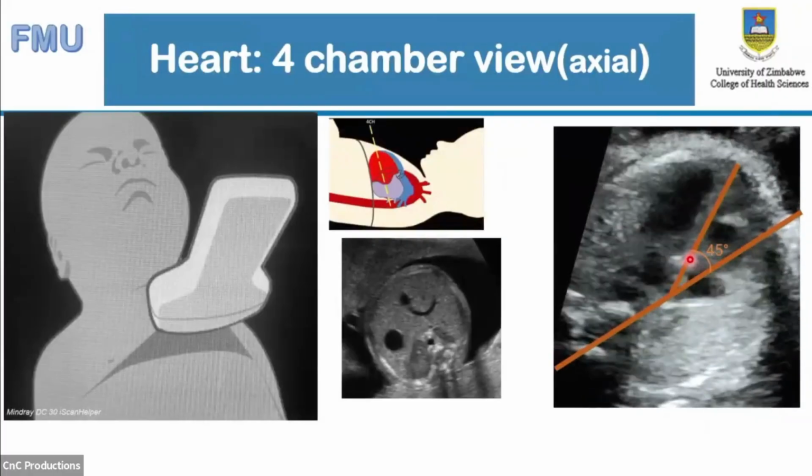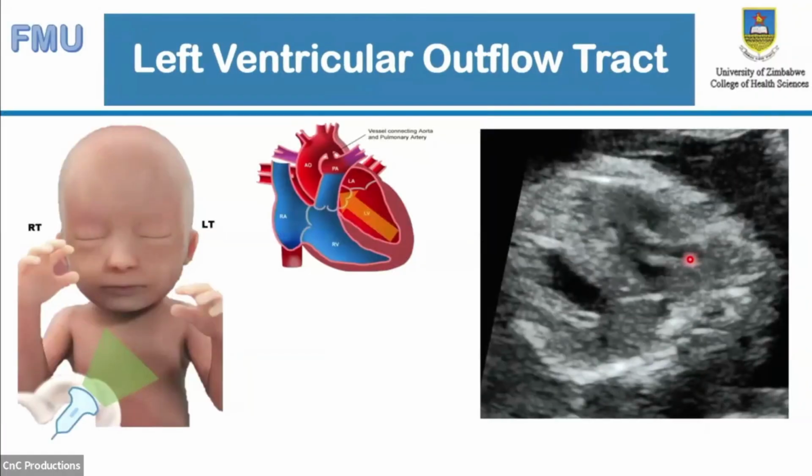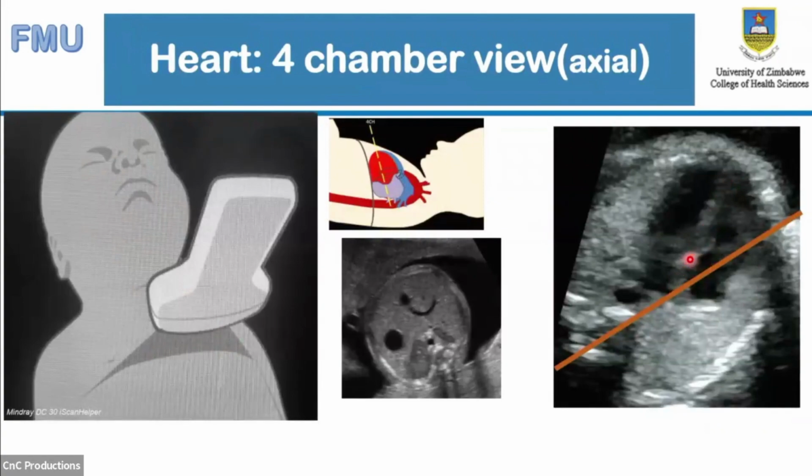Then we move on to assess the ventricles now. The morphologic left ventricle should be apex forming without anything inside.